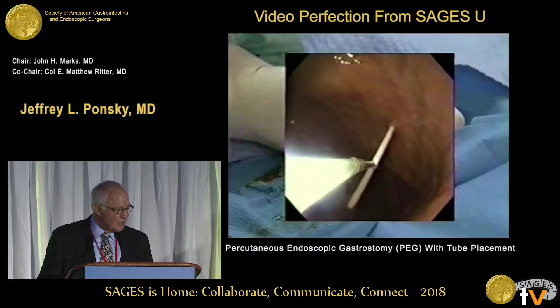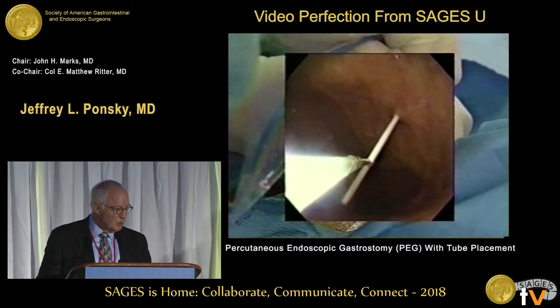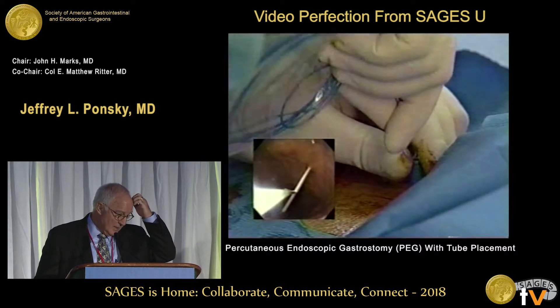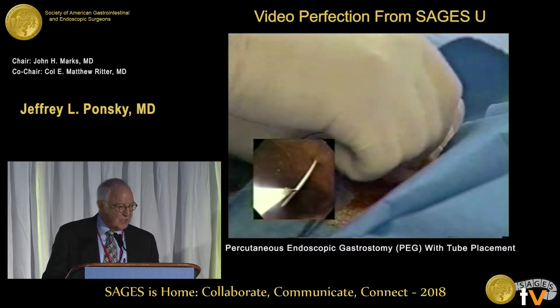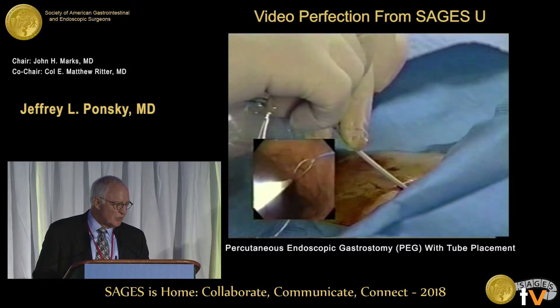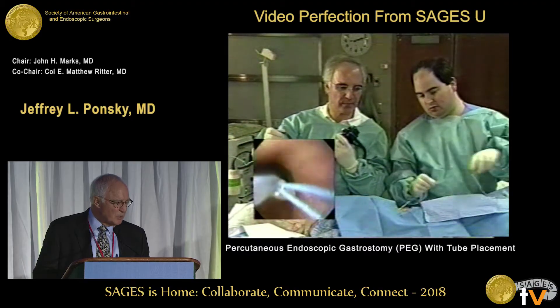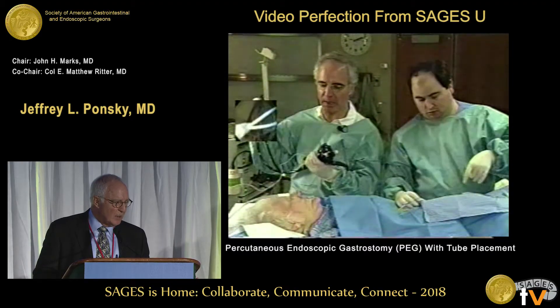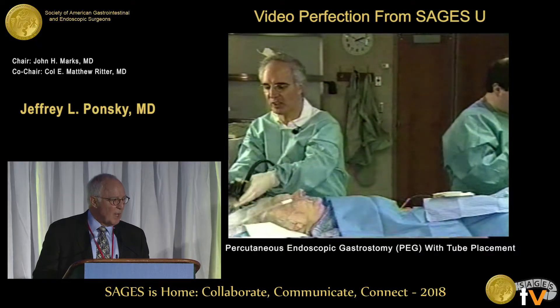You tighten the snare and take out the stylet, then put in the loop suture. As simple as this is, you follow the technique or you get in trouble. Once the suture is well into the stomach, we loosen the snare, grab the suture, tighten it, and we don't try to pull it up into the channel — you just pull it out and leave the snare in the scope. I'll show you why: this makes the second passage of the scope much easier.